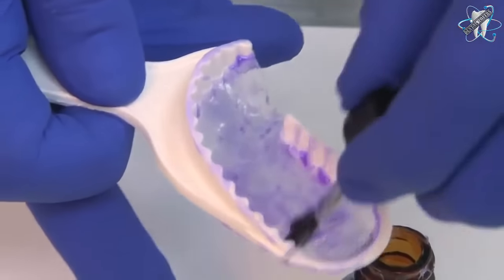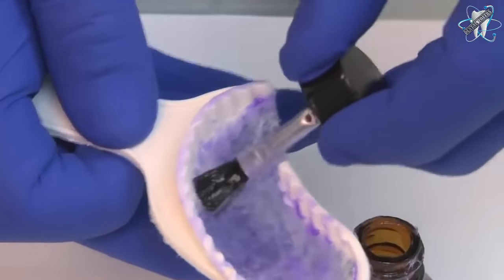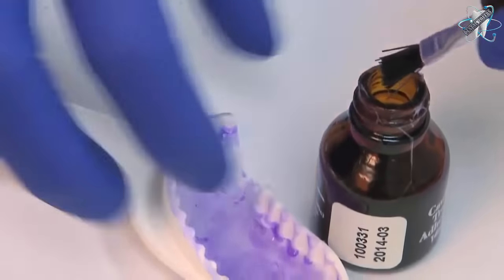Using a first bite closed bite tray, apply tray adhesive onto both sides of the tray. Set the tray aside and begin the process of preparing the tooth for syringing.